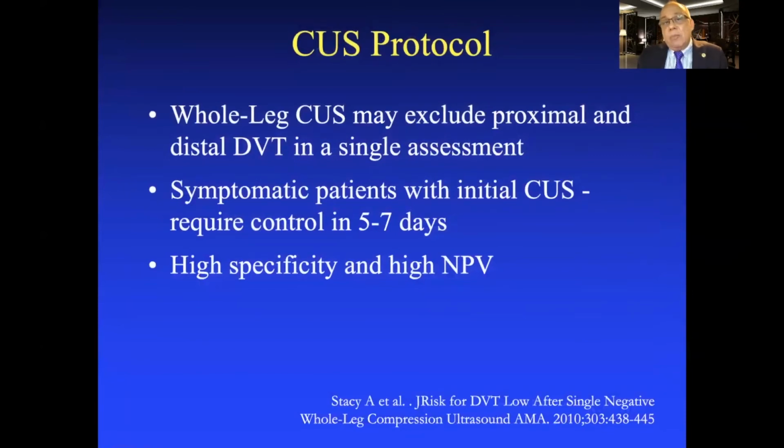The whole leg compressive ultrasound may exclude proximal and distal DVT in a single assessment. Symptomatic patients, attention, symptomatic patients with an initial negative compressive ultrasound could require a control in 5 to 7 days if no clinical reason was discovered to explain the symptoms referred by the patient.